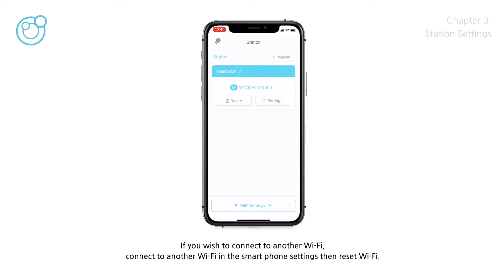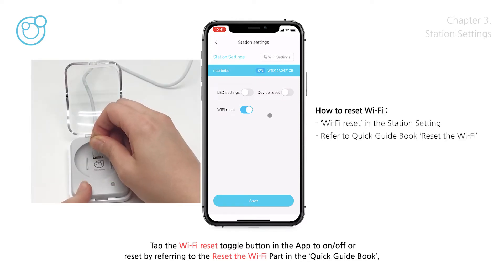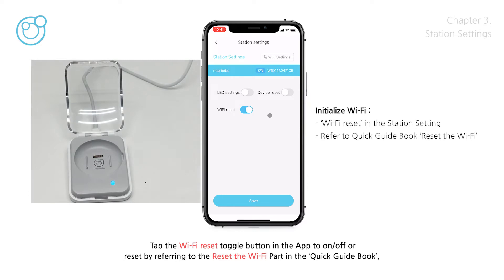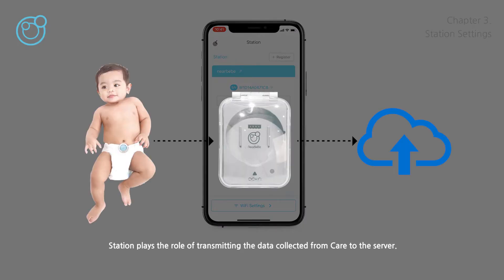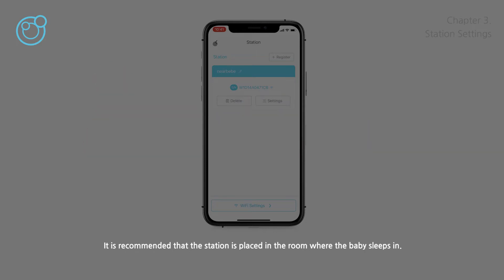If you wish to connect to another Wi-Fi, connect to the new Wi-Fi in the smartphone settings, then reset Wi-Fi. There are two ways of resetting: tap the Wi-Fi reset toggle button in the app to on/off, or reset by referring to the reset Wi-Fi section in the quick guide book. The station plays the role of transmitting the data collected from care to the server. Therefore, the station has to be connected to Wi-Fi at all times, and a certain distance has to be maintained with care so that signals can be sent and received. It is recommended that the station is placed in the room where the baby sleeps.